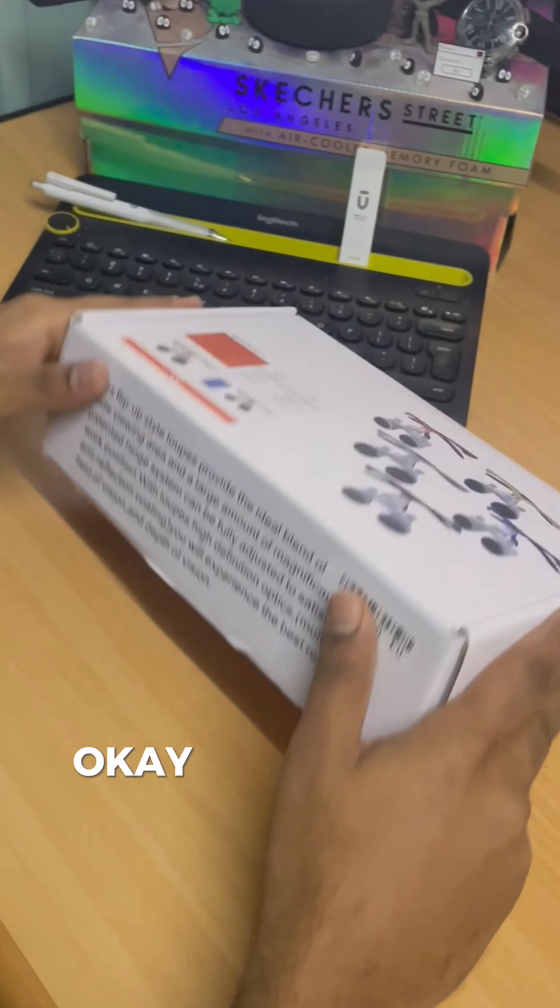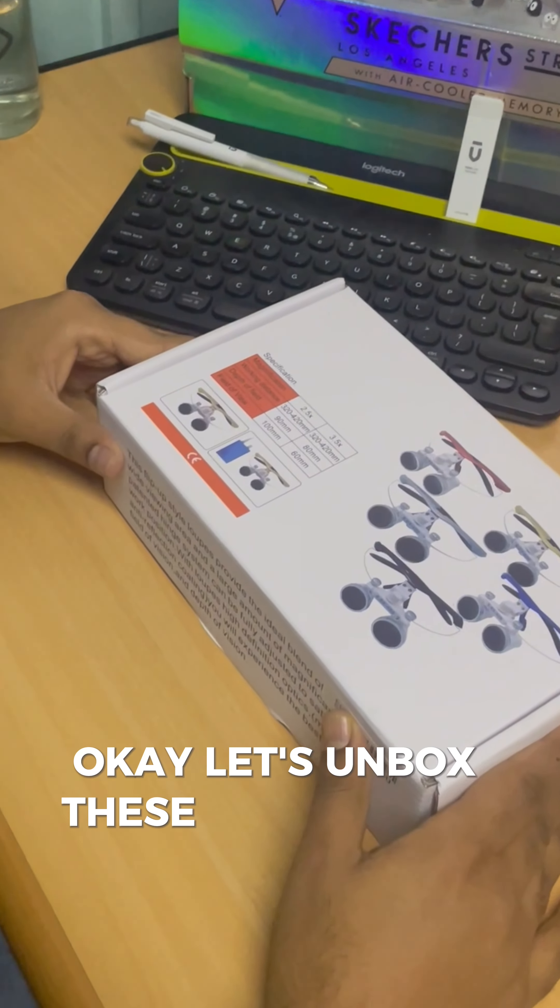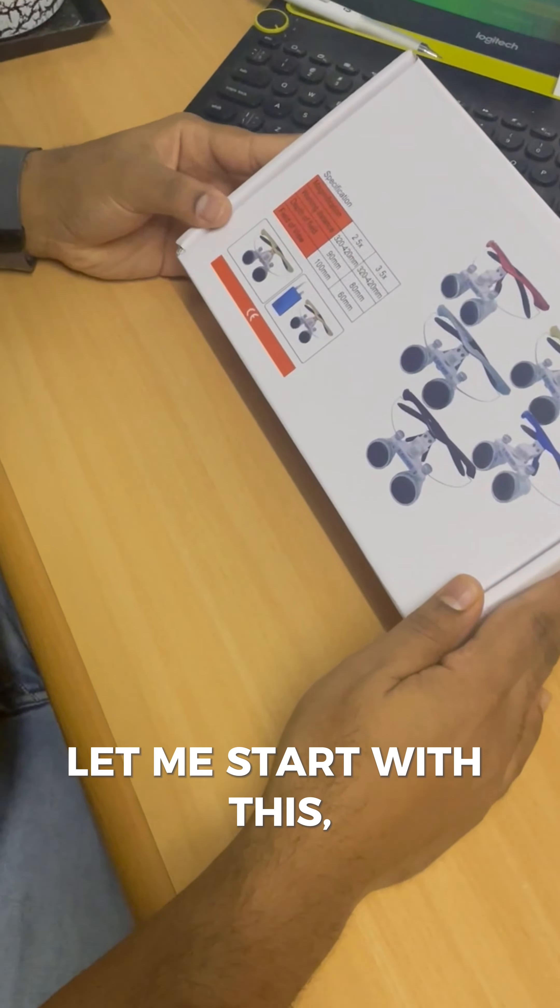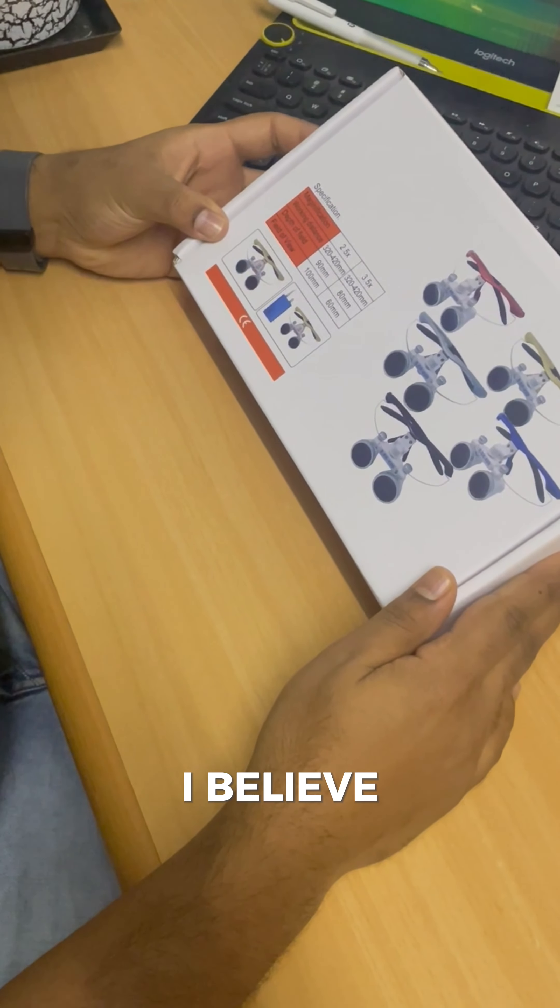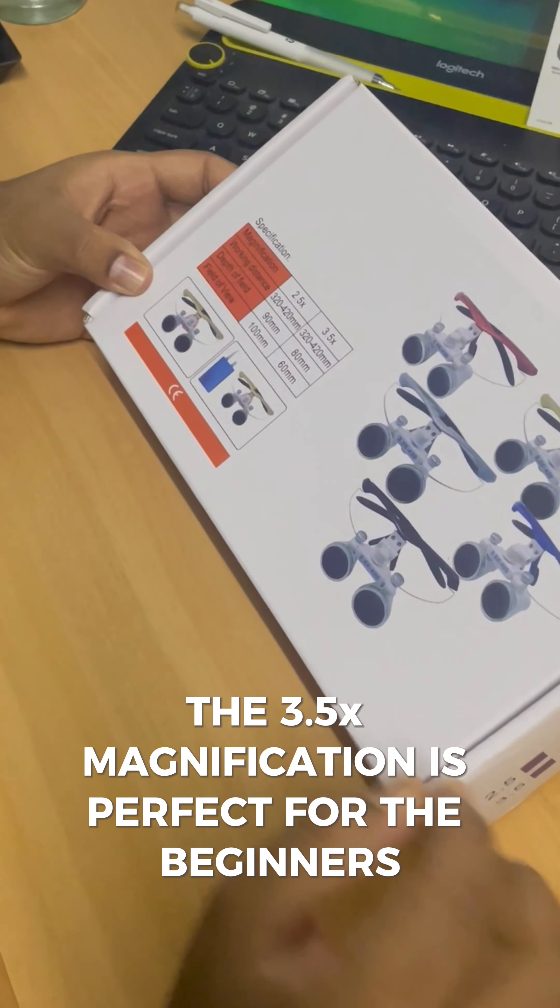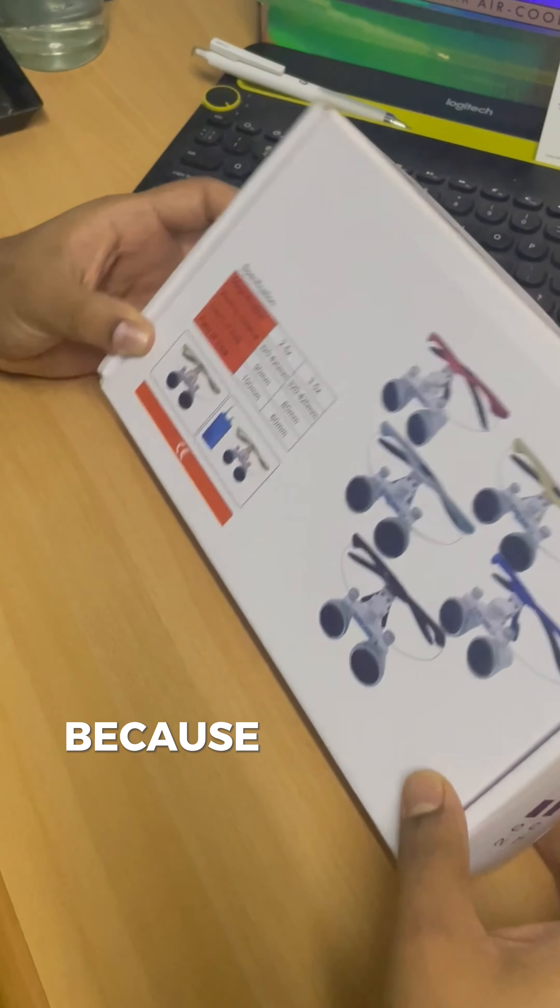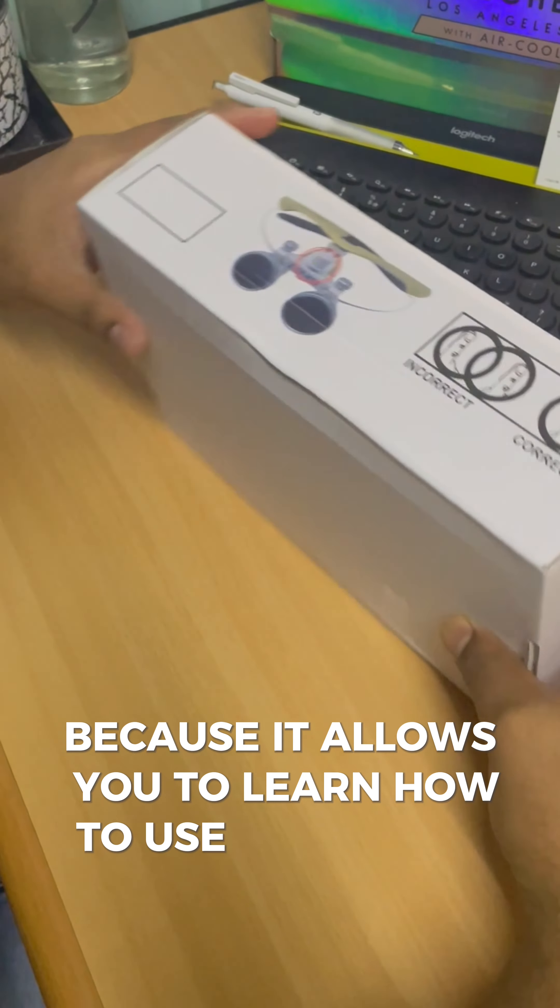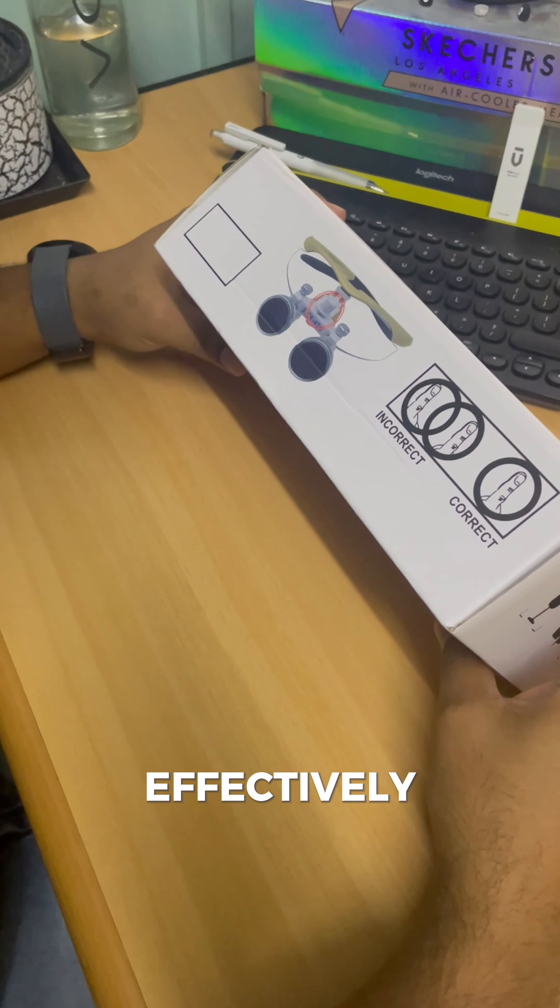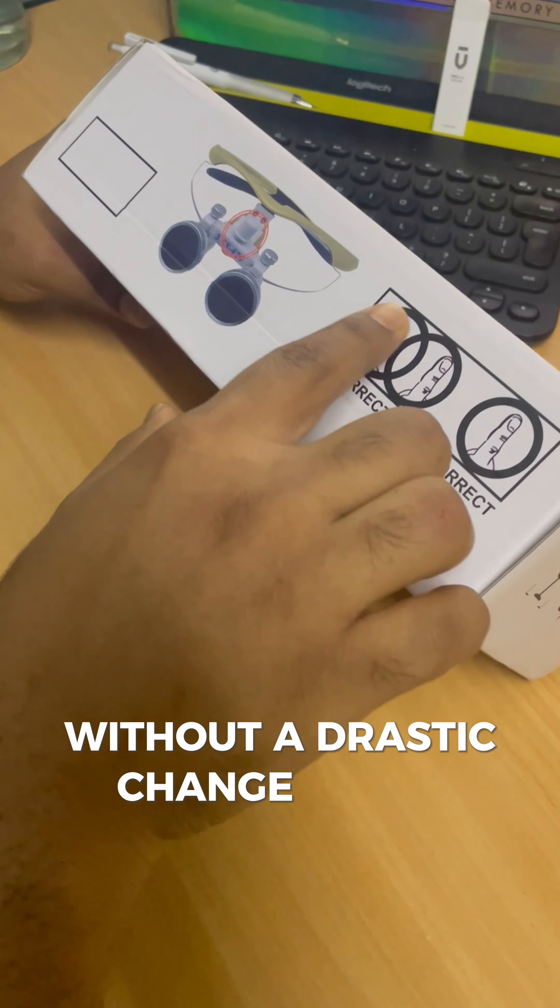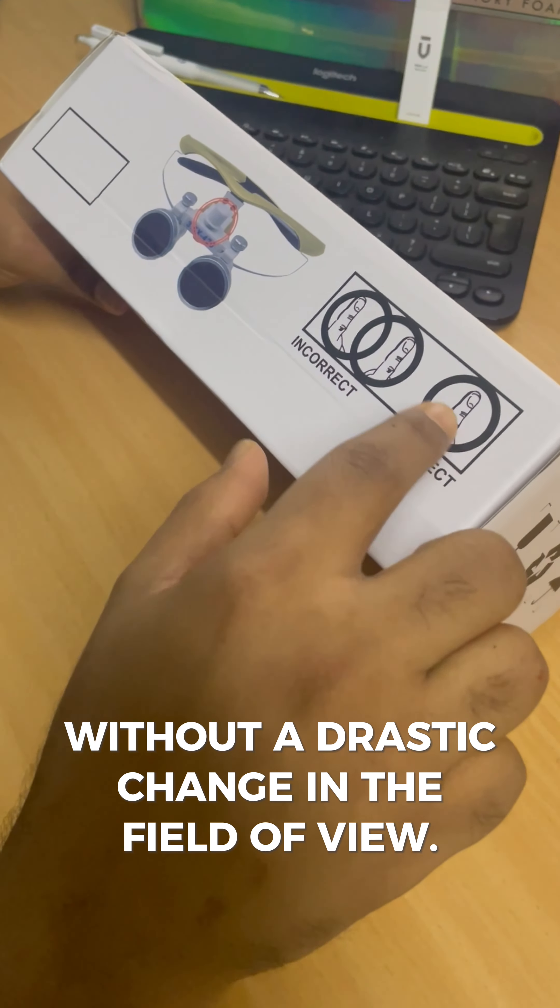Okay, let's unbox these loupes now. Let me start with this. I believe the 3.5x magnification is perfect for beginners because it allows you to learn how to use the loupes effectively without a drastic change in the field of view.